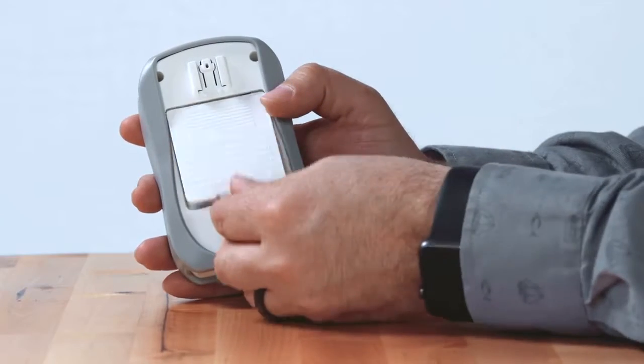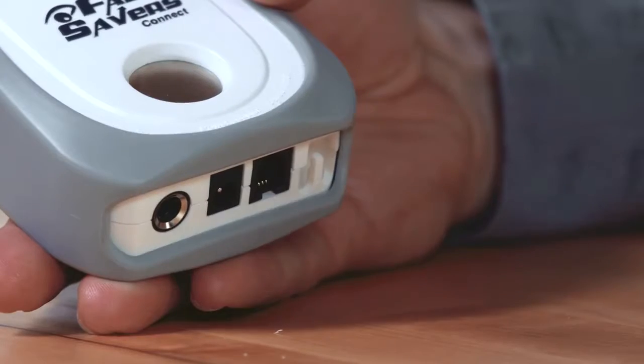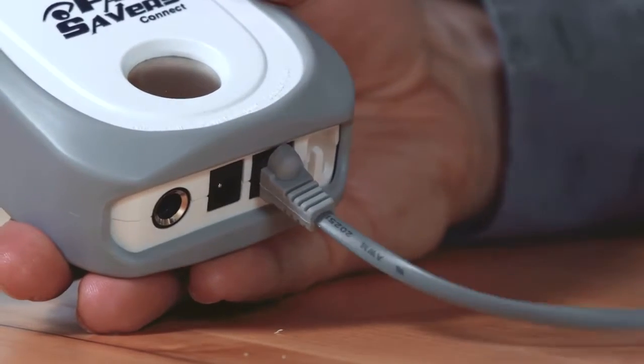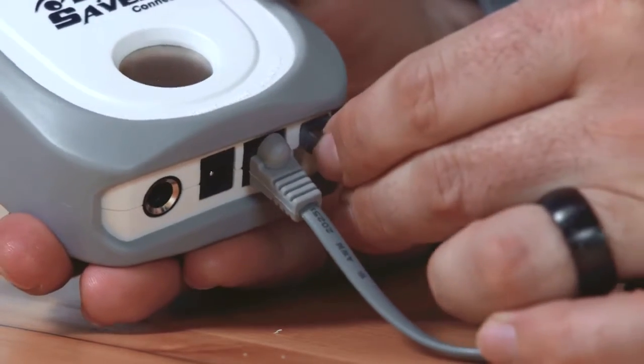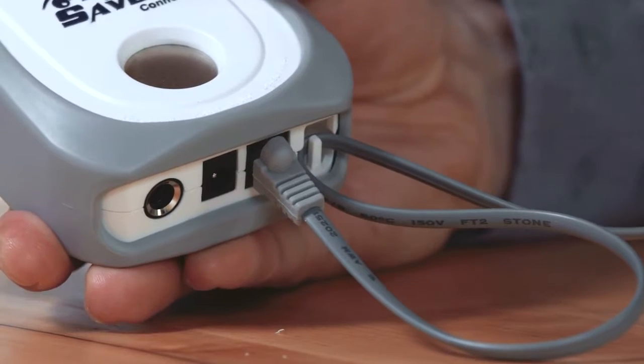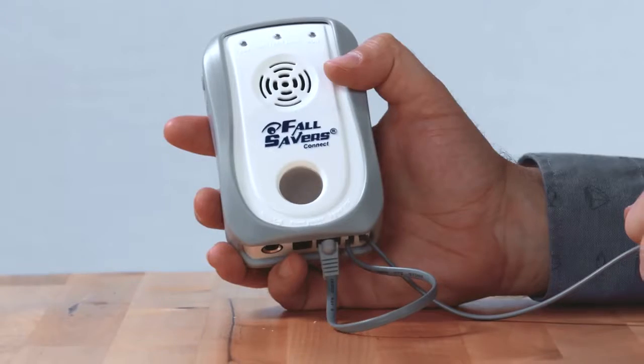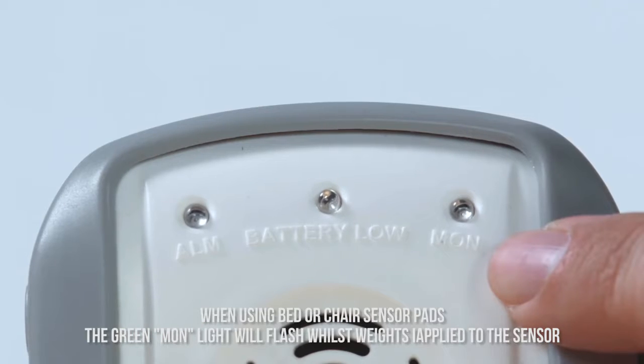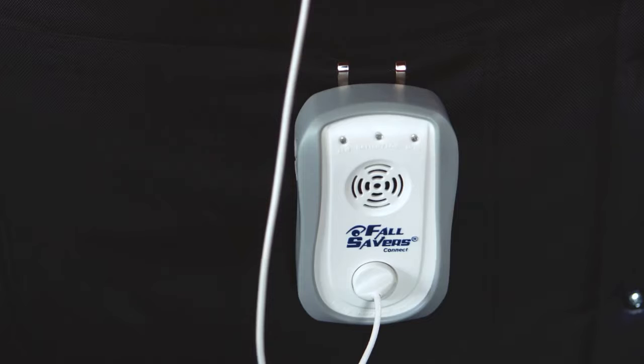Once your base unit is set up, you need to insert a bed, chair or floor sensor connector into the sensor pad receptacle at the bottom of the FallSavers Connect base unit. Now hook the sensor cord into the cord strain relief bracket to the far right of the base unit. This is important to limit the strain being put on the sensor pad connector if the cable is pulled on. Next, check that the power source is working, indicated by the green monitor light flashing periodically.